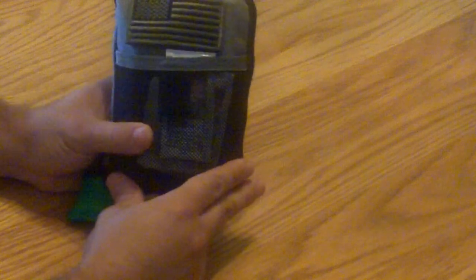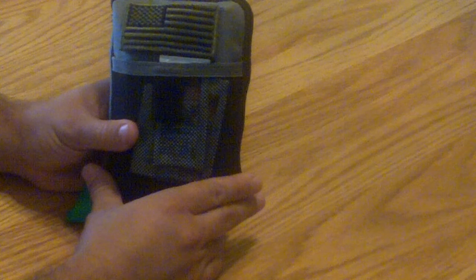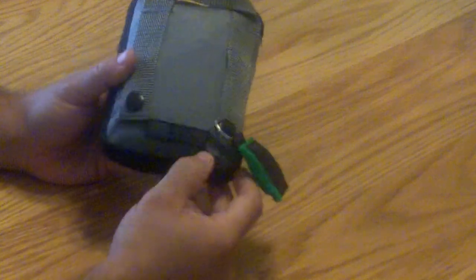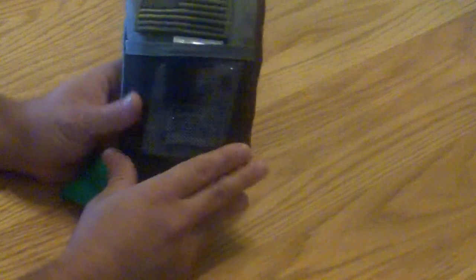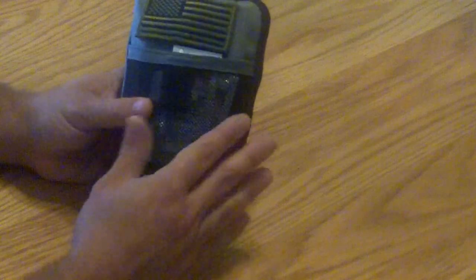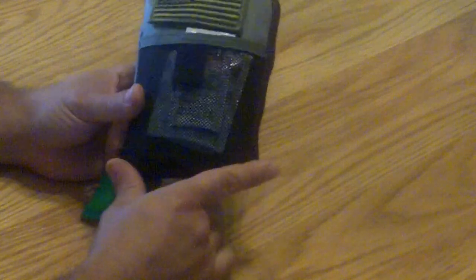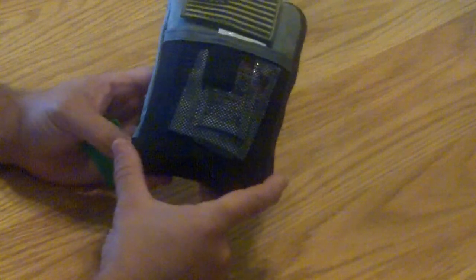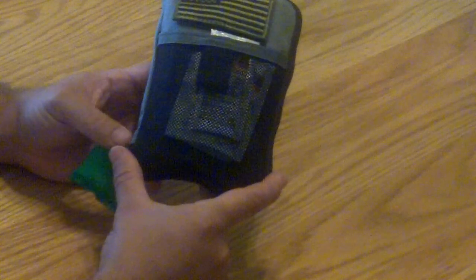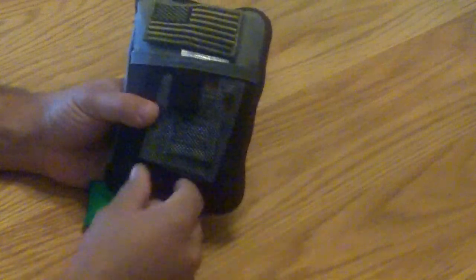I'm going to go over my little EDC first aid kit. I have a couple of these made up. This is a County Comm pocket organizer made by Meritat. It's built very well, I'm very pleased with it — for the price you can't beat it. This is just my first aid kit that I keep with me. I have one in my work EDC and also one in my regular everyday EDC that I toss in the truck when I'm out around town. Again, it's a County Comm organizer.